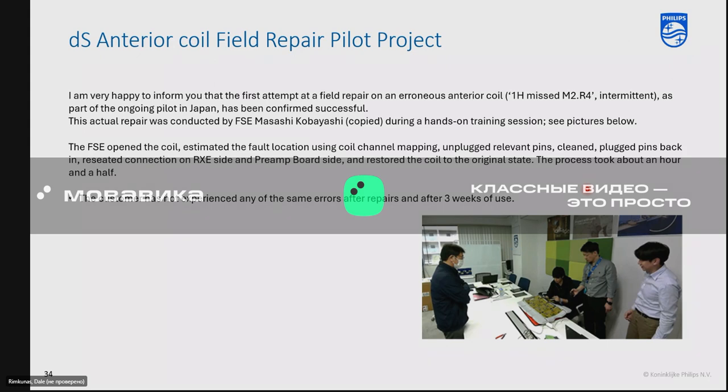It has not concluded yet, so we don't know how far we're going to progress with this. But I know actually some people have opened these coils in the field. I know particularly from Meta that some of these coils have been opened and fixed in the field. I want to show that we are listening and trying to support what we can. My initial recommendation was to not allow them to support this, but I want you to see what may be coming up in the future.